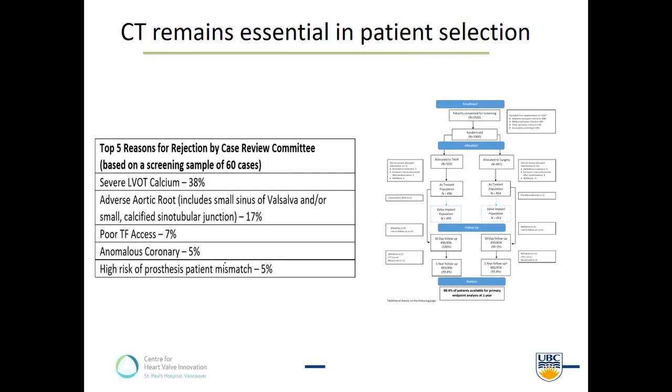But I would highlight some important work done by our lab and led by Philip Blanke, who you'll hear from in a moment: it's not that all comers underwent TAVR, at least in this trial with the balloon expandable device. Every week there was a case review call, and every week Philip was on that call, and every week there was a discussion about the patient-specific anatomy. So there's a significant number of patients that were screened out due to adverse root features.